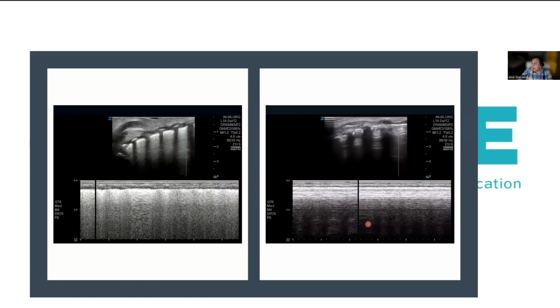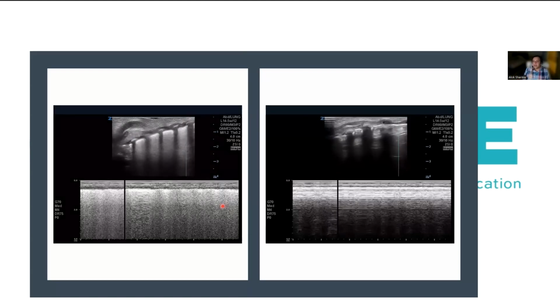But if you do puncture the lung, then lung ultrasound is hugely beneficial. What you can clearly see from our perspective is a classical seashore sign here in a baby who's got pleura which is sliding, with a B profile. So there's no evidence of a pneumothorax here. But when I look at the image on the right, I can see no lung sliding in a baby who's got horizontal lines, which we call A lines, with a classical barcode sign. So if I did puncture the lung, I can do an ultrasound immediately to diagnose that pneumothorax.